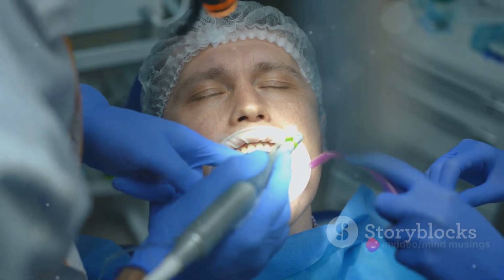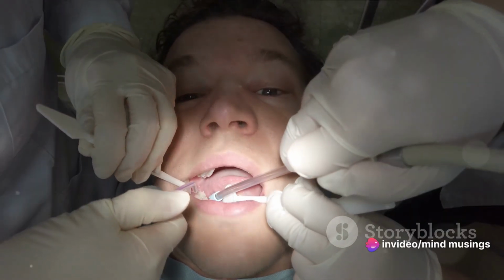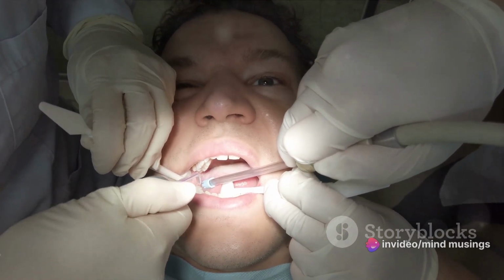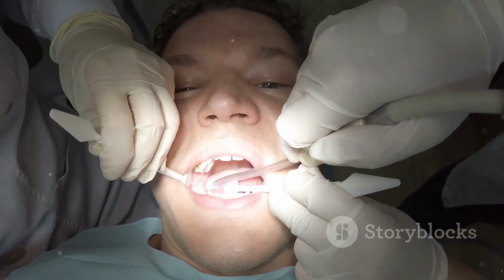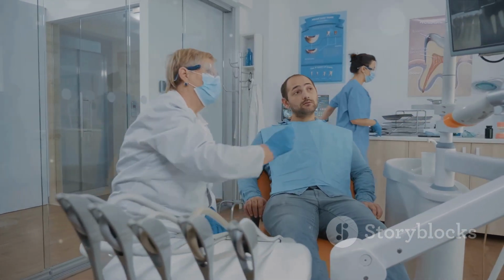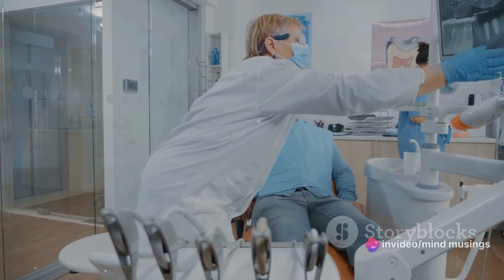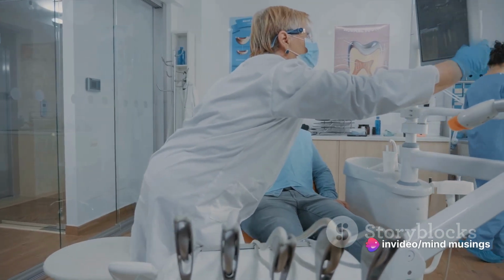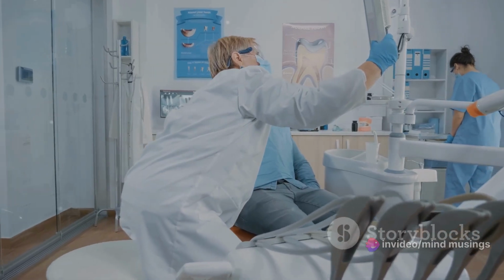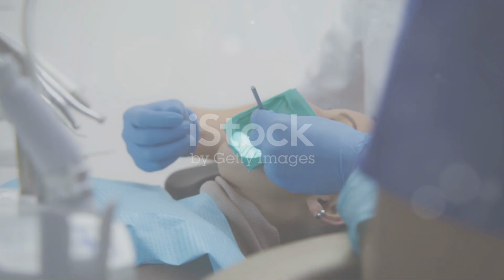If the patient feels any sensation, it indicates that the pulp is still vital and the tooth is healthy. However, if there's no sensation, it could mean the pulp is non-vital. Remember, the aim is not to reach the pulp, but to get close enough to test its vitality. If the pulp is inadvertently exposed, it may need to be treated, or the tooth may require a root canal treatment. After the procedure, the cavity is filled with a temporary filling material.